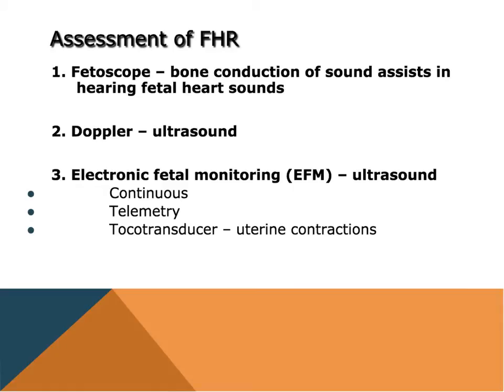It is completely fine to keep them off the electronic fetal monitoring and do a Doppler protocol where we're listening to that fetal heart rate at prescribed times, where when she gets all the way up to pushing for labor, she is going to be monitored with every contraction with that Doppler. So it is a really clear protocol, hospital to hospital, of how to use the Doppler.